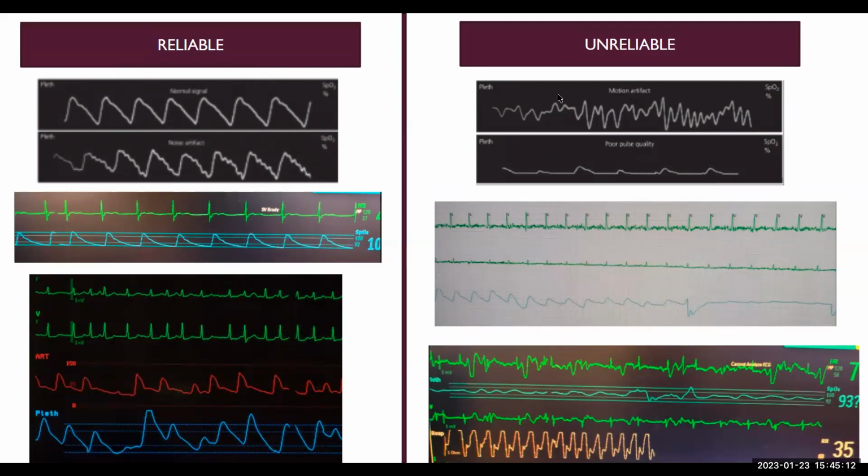And then when they got a bigger pause somewhere in the middle, then you see that it slowly starts building up and the waveform becomes bigger, and corresponding to that, the pulse ox also gets bigger. So it is kind of advanced to be able to pay attention to these subtleties, but the pulse oximeter is a really interesting second by second surrogate of your tissue perfusion.